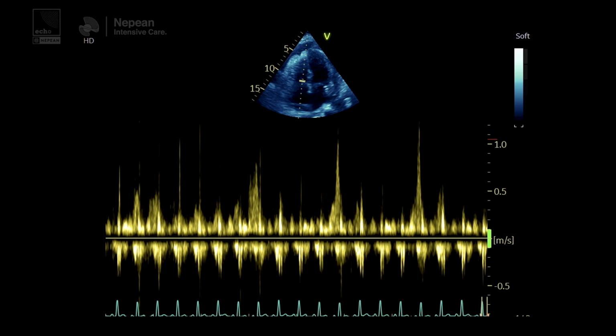Patients being ventilated is probably one of the most relevant for us. Although you'd potentially expect a reverse relationship between when you get the peaks and the troughs, it doesn't consistently demonstrate that, and it's not validated to be used for diagnosing tamponade. It's not quite as simple as the reverse pulsus paradoxus that we talk about. And Andrew Hilton writes about this beautifully in the Critical Care Echo book. He was a real aficionado talking about this heart-lung interaction and how all that changes.